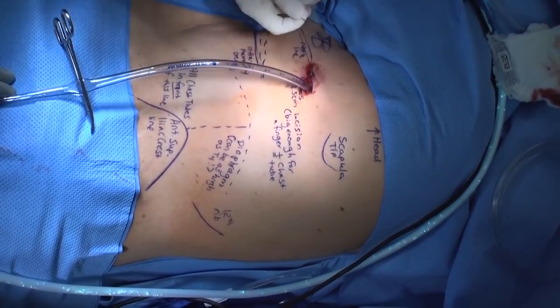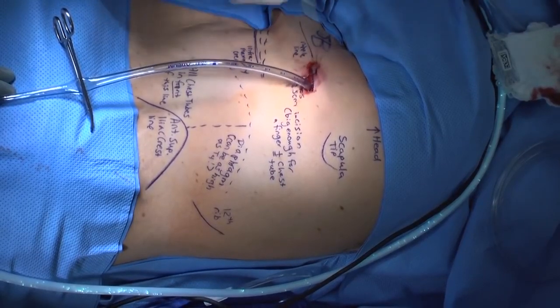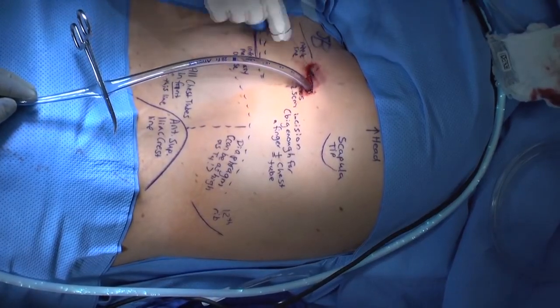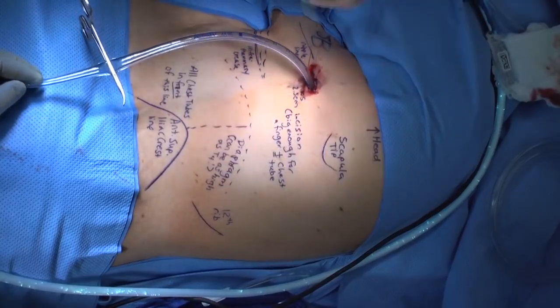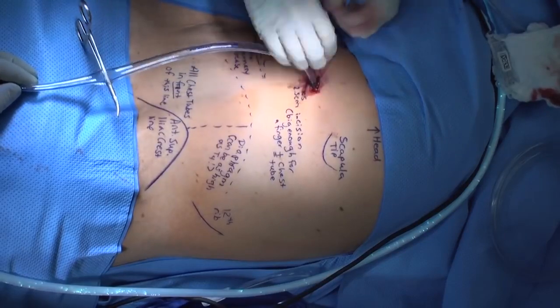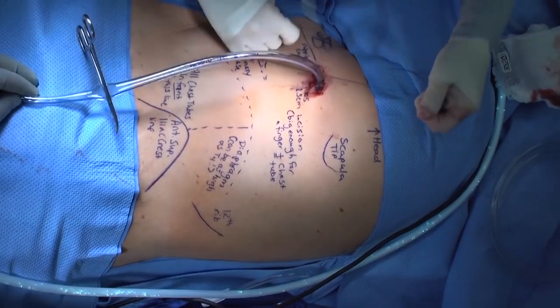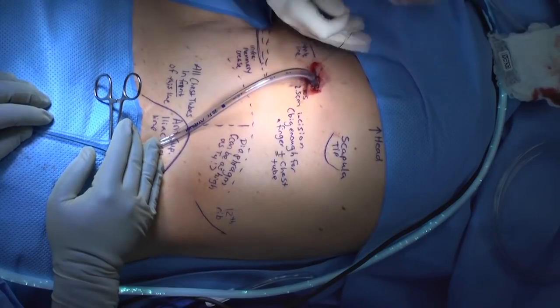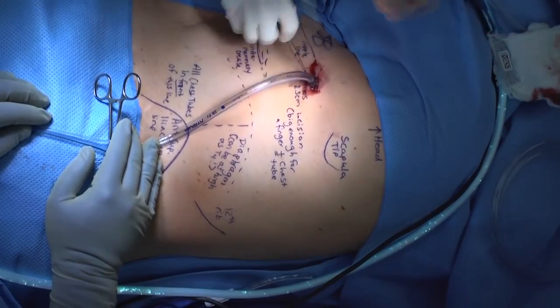Once you have a little bit of a trail, go around this chest tube several times. Cinch down to create a small waist on the chest tube, not enough that you're going to impede drainage, but enough to hold the chest tube securely. Put a couple of additional knots, then go around a second time to re-secure the tube. Chest tubes should never accidentally fall out due to an inadequately secured tube.